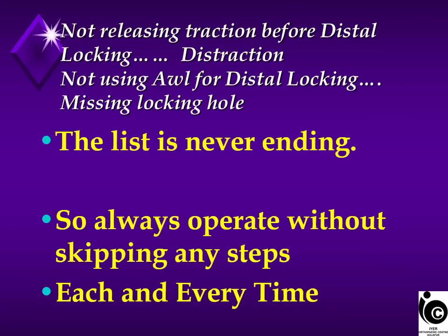Friends, there are so many other things, like not releasing the traction before distal locking, causing distraction of the fracture site. Not using an awl for distal locking, so that the soft tissue or the tensor fascia lata pushes the sleeve anterior posteriorly, leading to improper distal locking. The list is never ending. So always operate without skipping any steps. Each and every time when you operate, all the steps should be religiously followed.